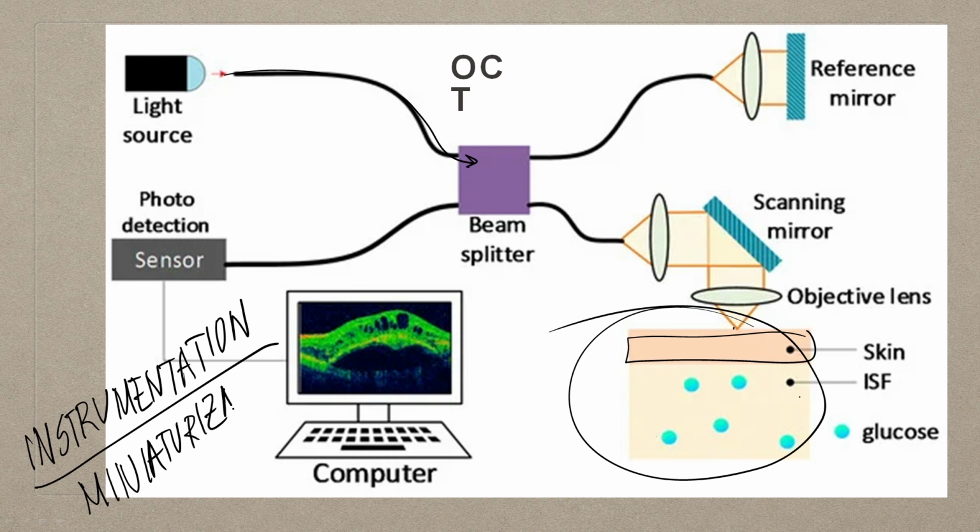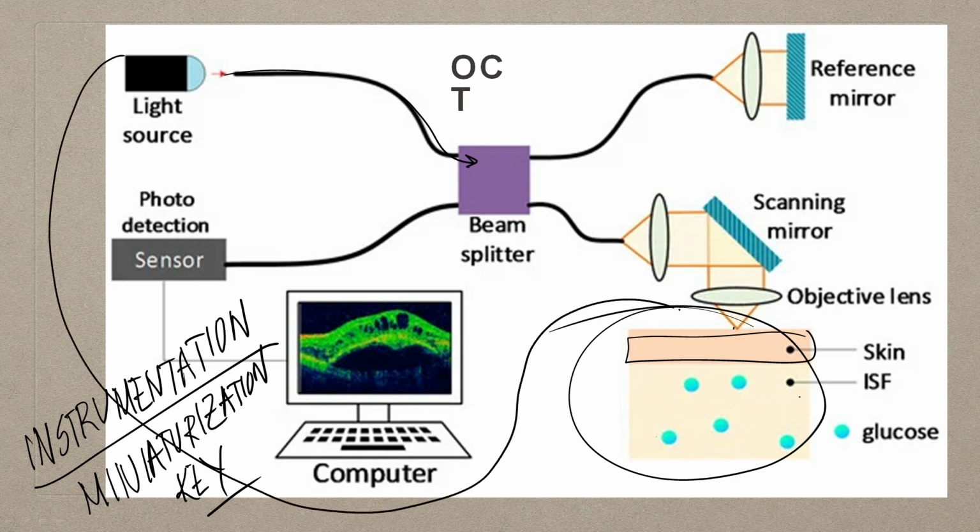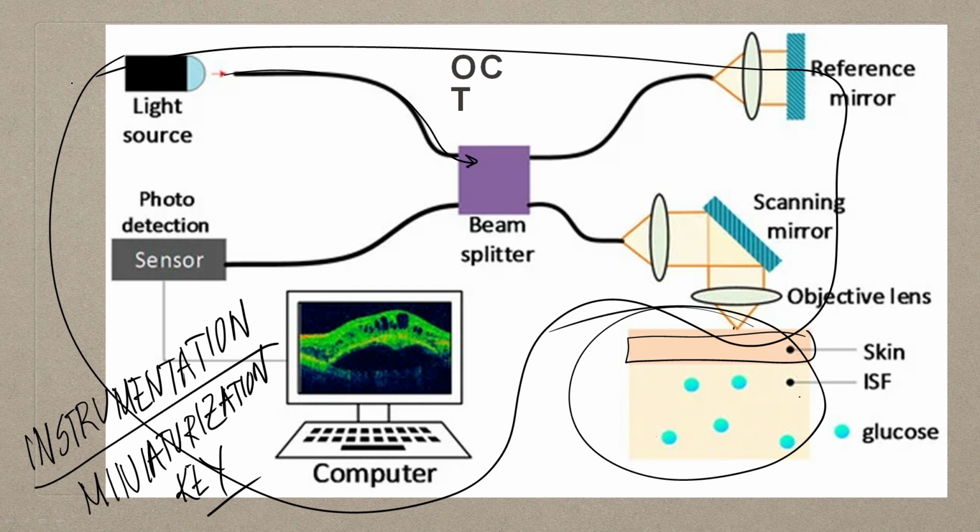Miniaturization is a key move. The smaller your whole setup is, the better your device sellability will be.